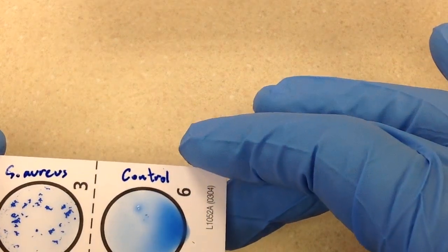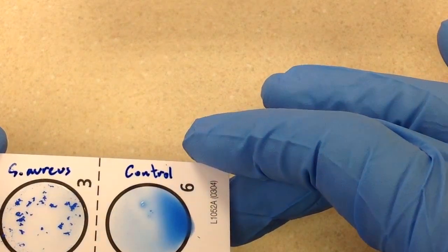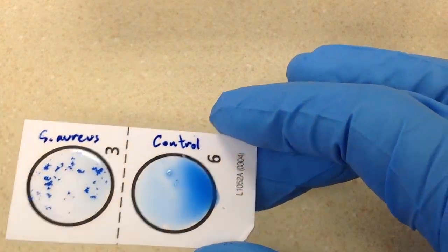That's it for the latex agglutination test for Staphylococcus aureus. Thank you.